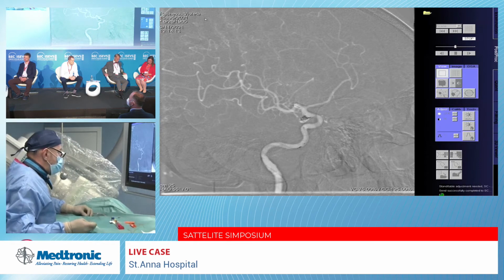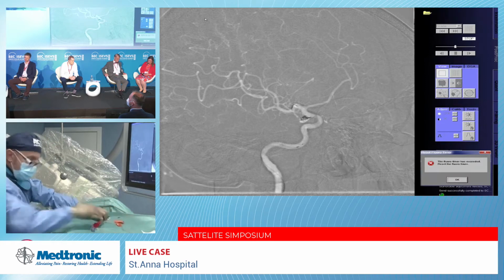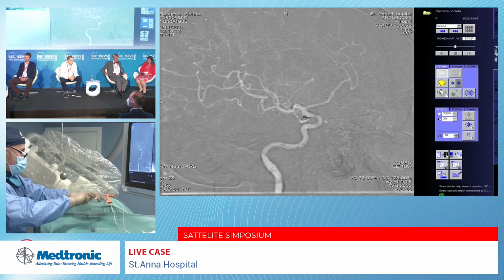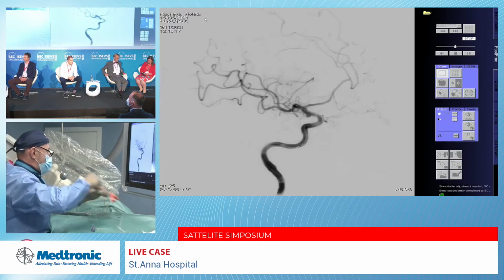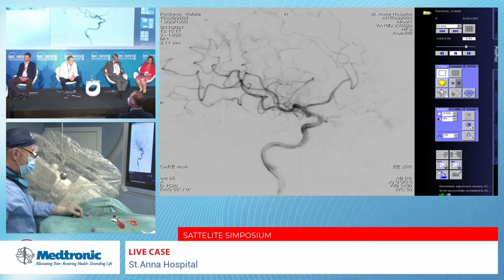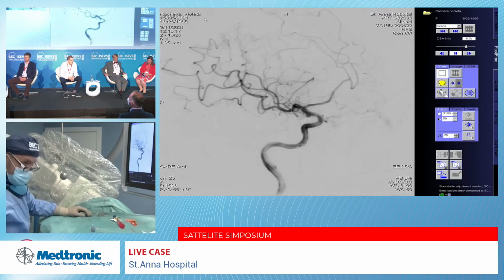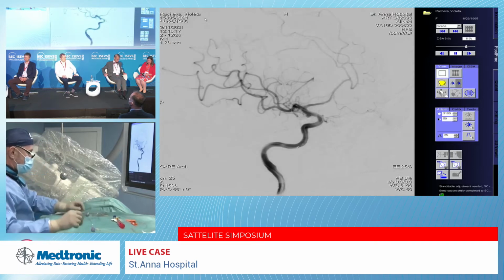It's extremely important to facilitate, in fact, to stimulate the apposition. So this is very important, and especially in brain vasculature that is so tortuous, this maneuver is very, very important. Absolutely. Hopefully, Iris, you will agree with me. It's not so simple like a coronary stent, push and inflate in 10 seconds. No, there is nothing to do. It's much, much more special.